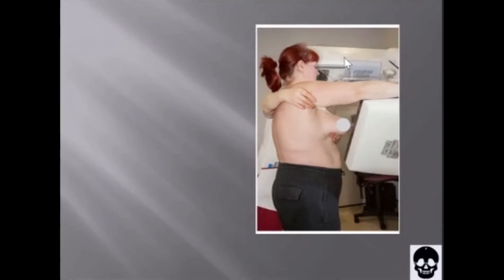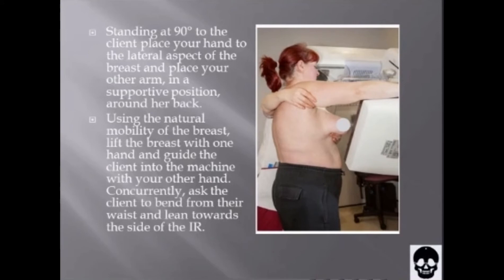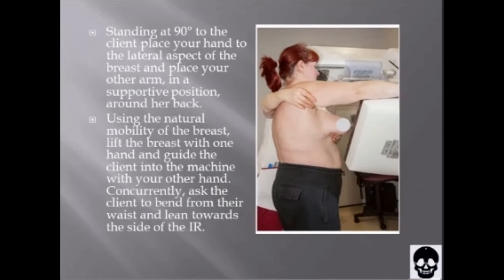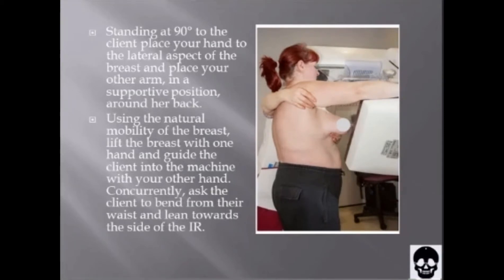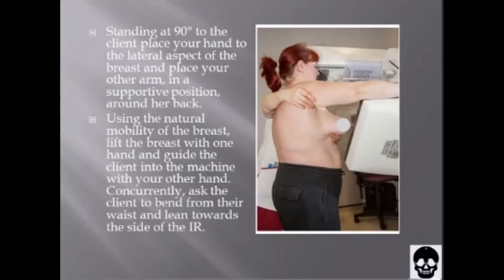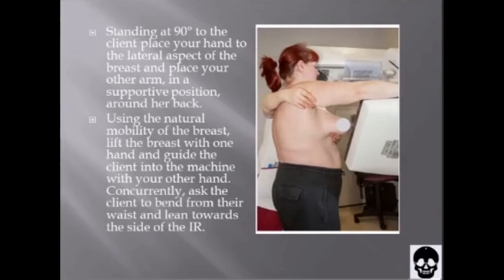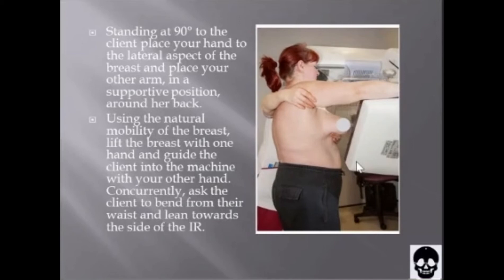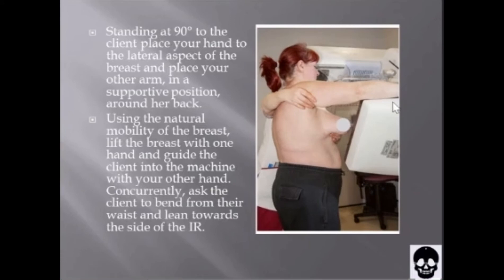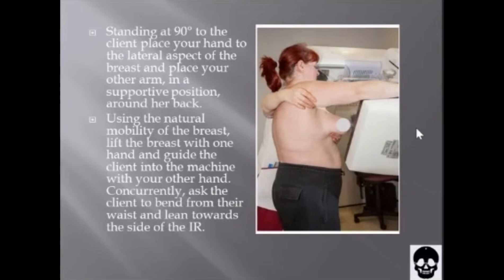This image shows supporting the breast and the arm. Standing at 90 degrees to the client, place your hand to the lateral aspect of the breast and place your other arm in the supported position around her back. Using the natural mobility of the breast, lift the breast with one hand and guide the client into the machine with your other hand. Ask the client to bend from their waist and lean towards the side of the IR. Move around to the back of the client and position her arm, lifting it upwards and gently reaching the shoulders over the IR. The corner of the IR should be seated into the axilla, mid-axillary line between the latissimus dorsi muscle and pectoral muscle, or in the space if the axilla is hollow.